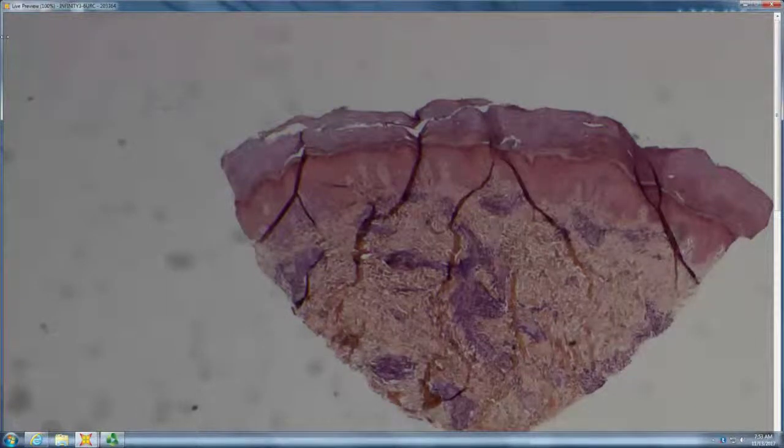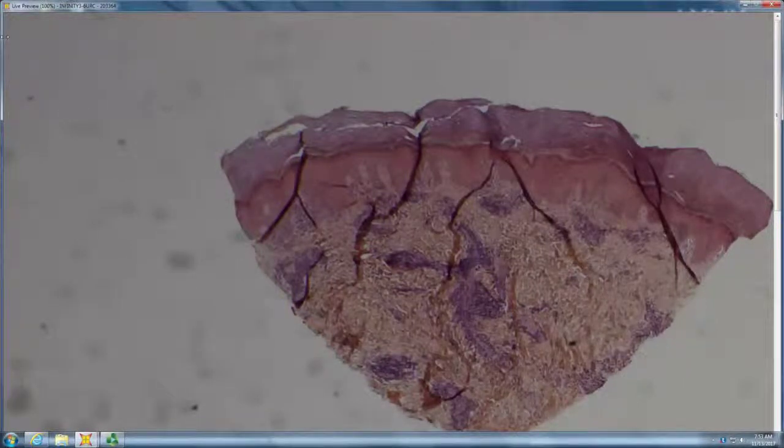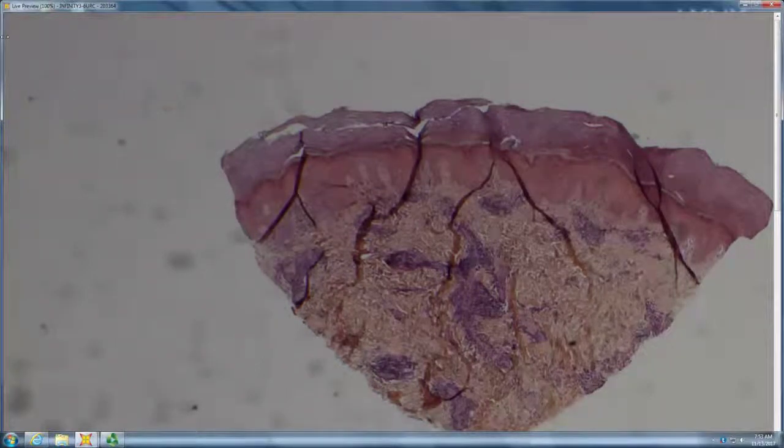Do you have to have eosinophils for granuloma faciale? Well, plus that should be perivascular. Okay. So GF should be a vasculitis. It should be perivascular. And I think it would be tough to call without eosinophils. EED may or may not have eosinophils, but GF pretty much always has eosinophils.